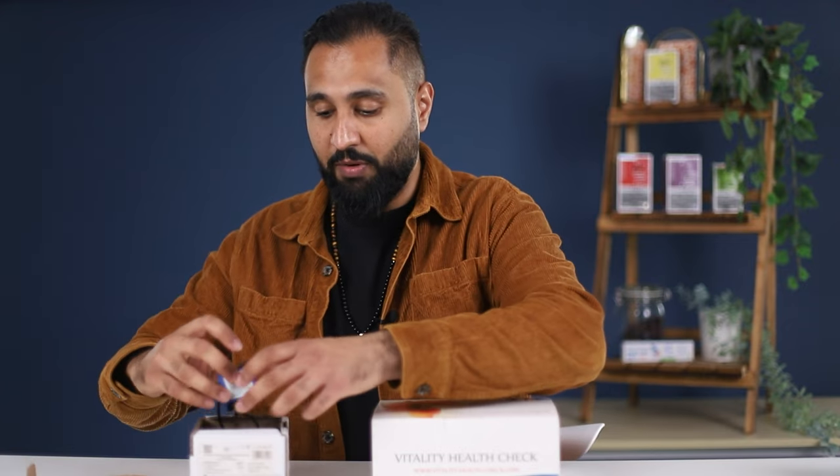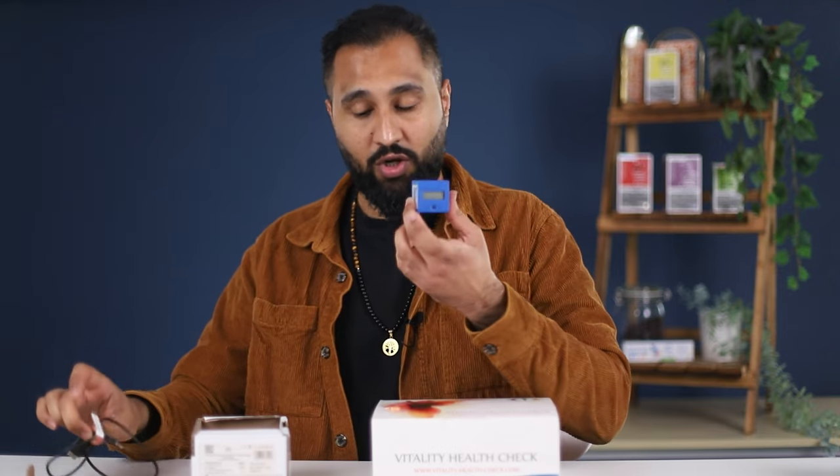So first we've got your test strips and you've got your reader. Your reader comes in two separate parts: you've got the data cable which connects up to your computer, and your actual physical reader and the cassette.